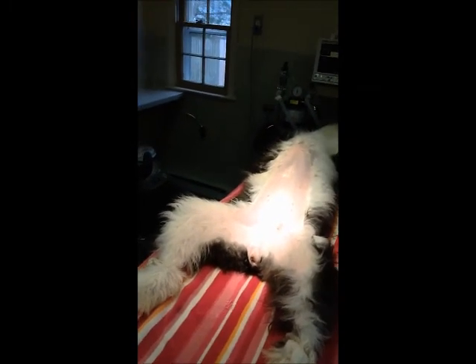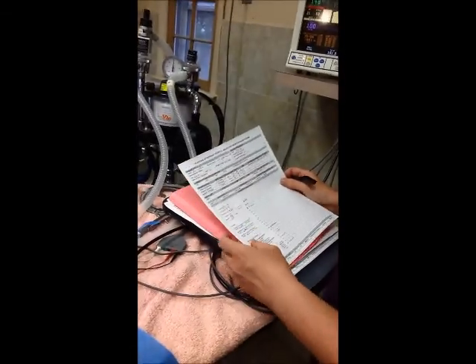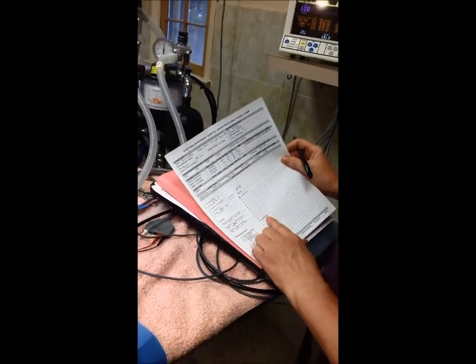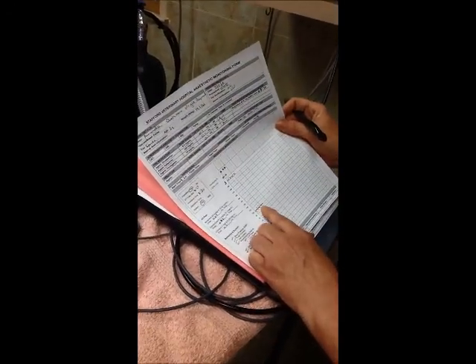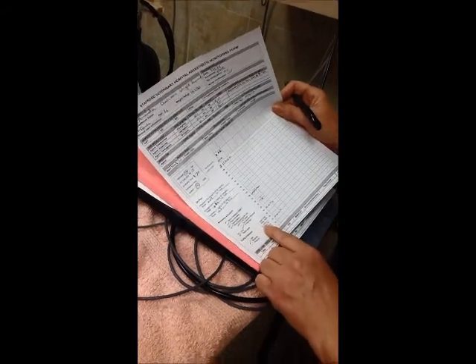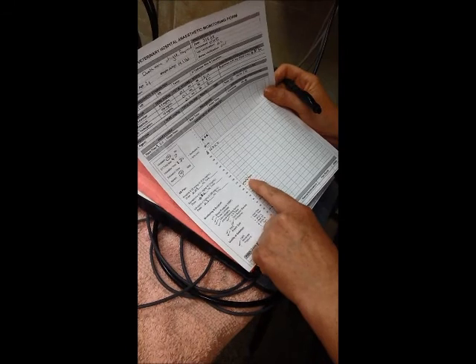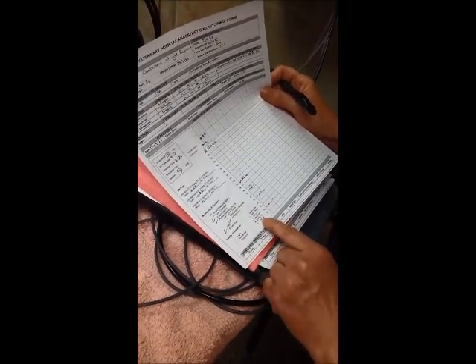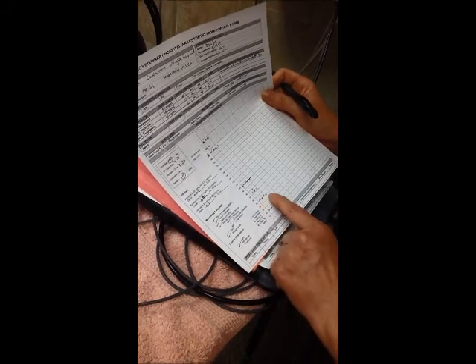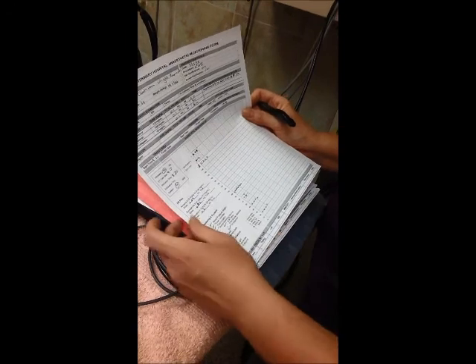This is for Amanda, she's a feline, we're spaying her, she's in the process of being spayed today. This is her SpO2 and her temperature. As you can see, her SpO2 and her temp is the sideways arrow. Her heart rate has been the closed dots, her respirations have been the open dots, and her EtCO2 has been the X's. And her blood pressures have been the lines.